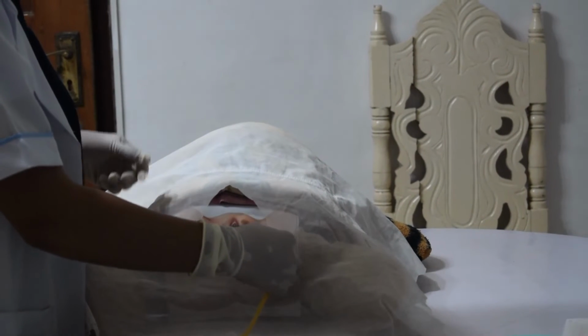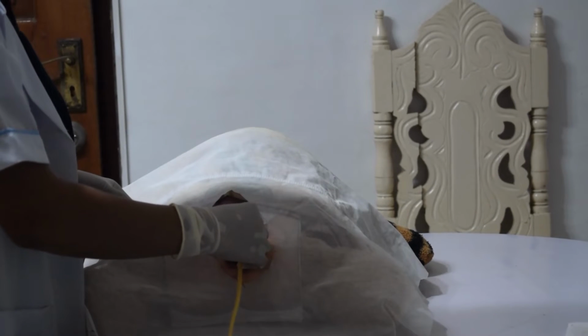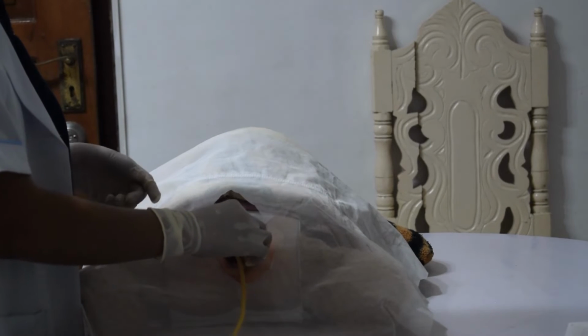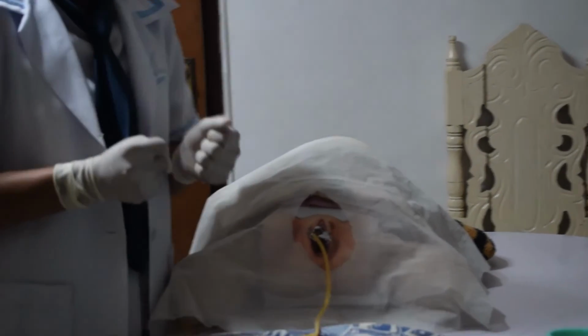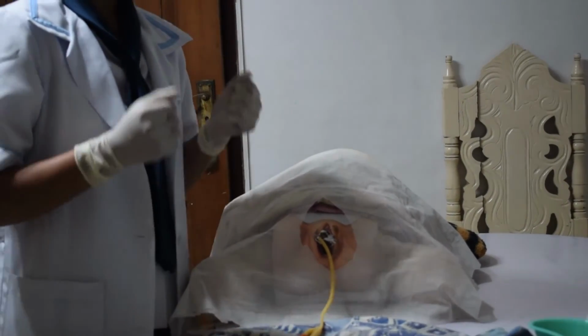Slight resistance is expected as the catheter passes through the sphincters. Advance the catheter 2 to 3 inches further after the urine begins to flow through it for the female.